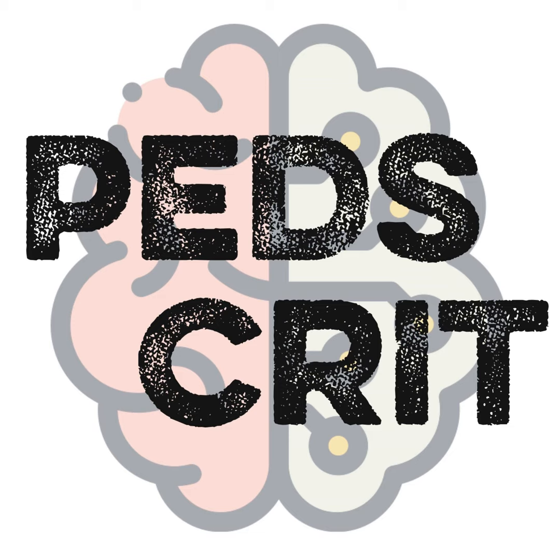Just to read this back, you're going to methodically lower their flows to something that's sub-physiologic, maybe 30 mLs per kilo. It's a rule of thumb. You're going to actually take clamps and clamp the ECMO circuit where it goes to the patient. Then you're going to serially check labs and do your clinical exam to see how well they're tolerating that. And maybe every 10 minutes or so, you have to flush out the ECMO circuit with fresh blood so nothing clots. And then make a clinical assessment after about an hour or so. That sound fair enough? Yeah.